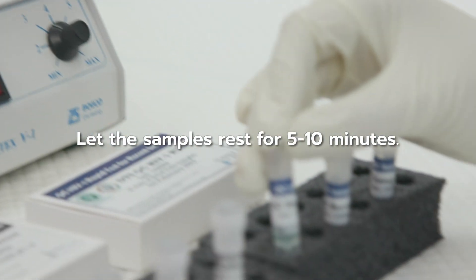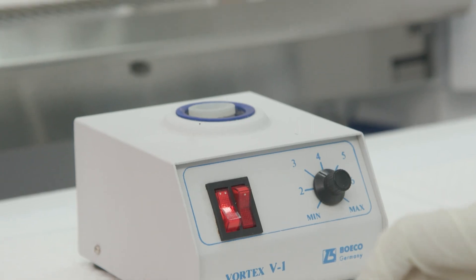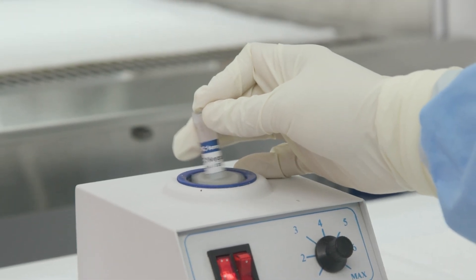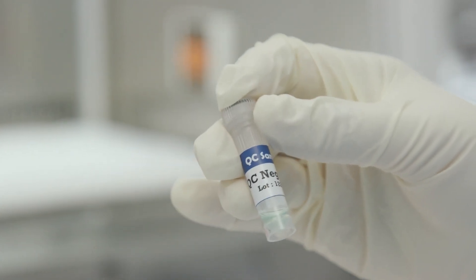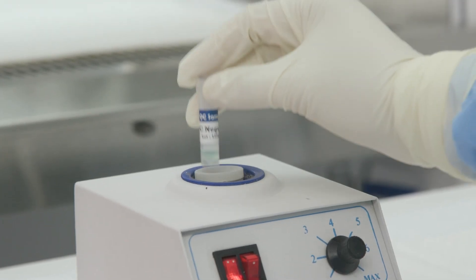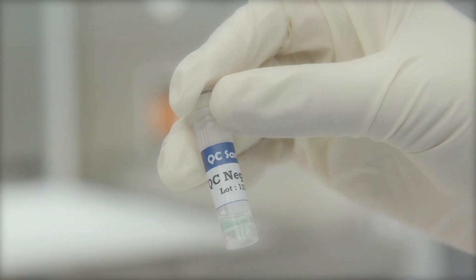Step 4: Let the samples rest for 5–10 minutes. Step 5: Mix the samples again with the vortex mixer for 10 seconds. Step 6: Check to see if the samples have completely dissolved. If not, let them rest for 5–10 minutes and mix again with the vortex mixer for 10 seconds. Step 7: The samples should be tested within the day that they are dissolved.